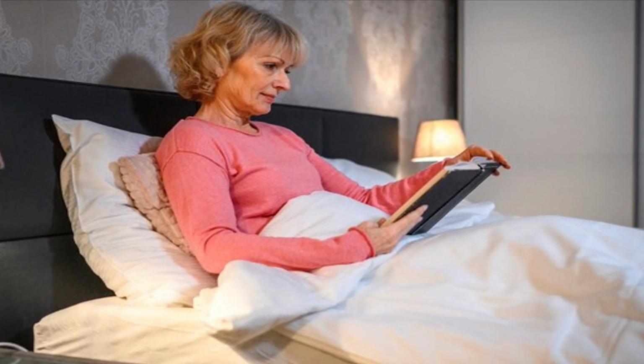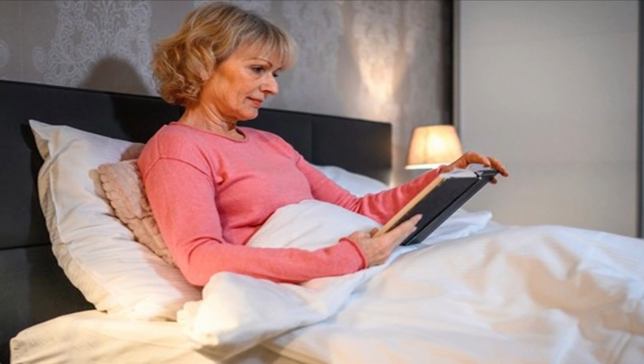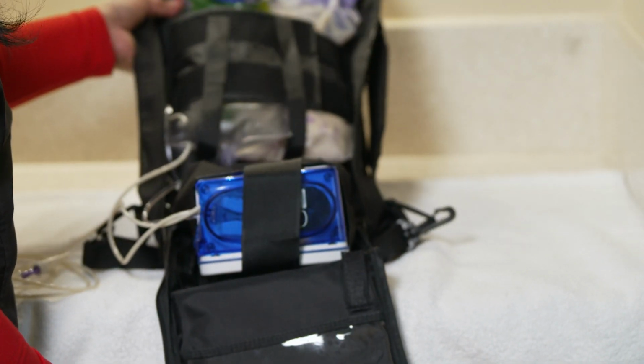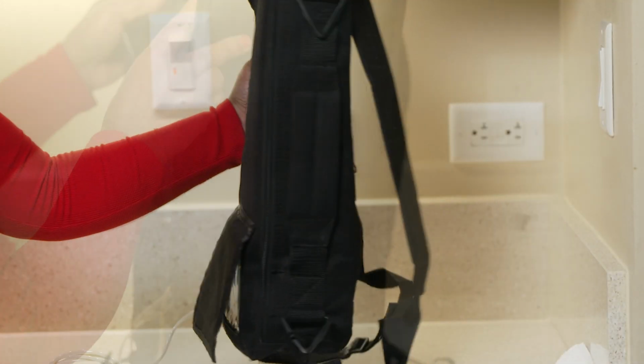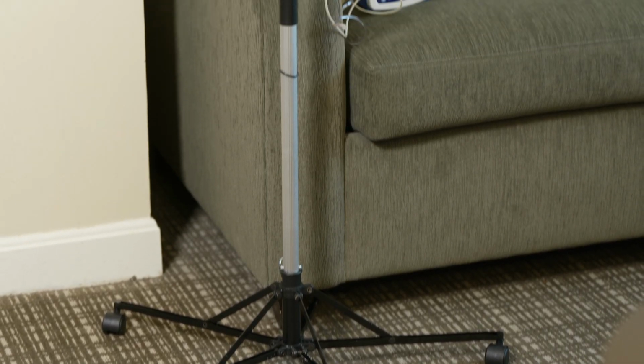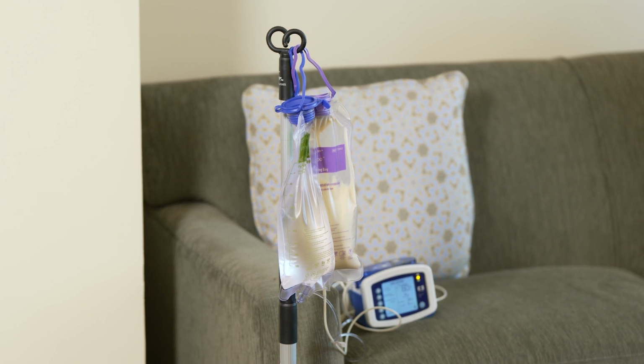Do not lie flat. When you are in bed, use at least 2 pillows or use a wedge pillow to prop yourself up. When you are away from home, use the backpack provided by the supply company. When you are feeding at night or when you are inactive, such as sitting in a chair, use the pole provided by the supply company.